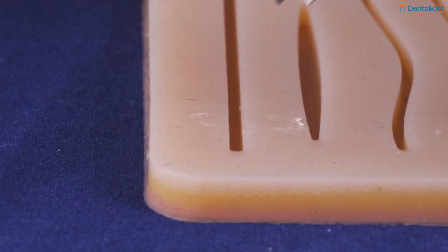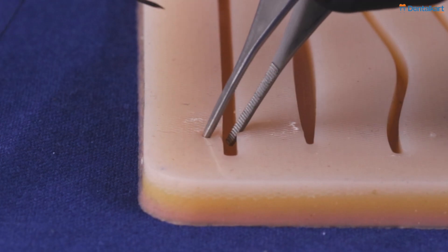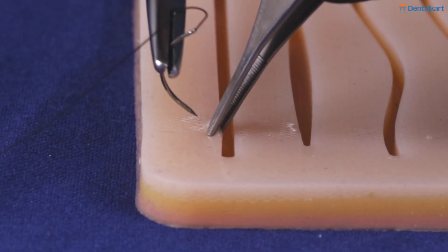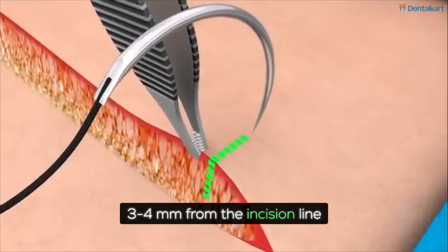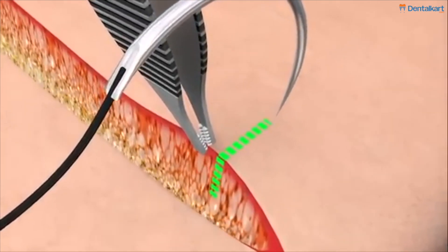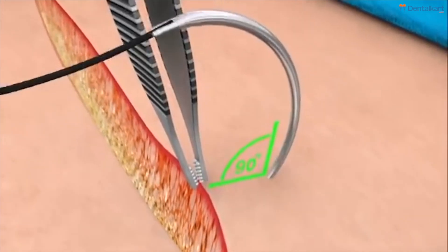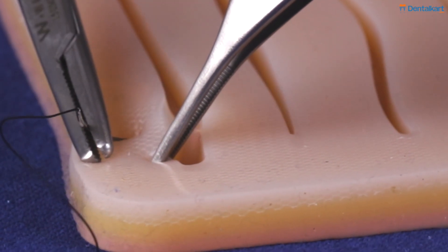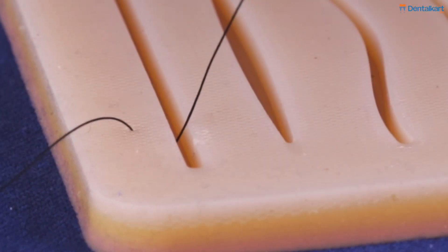Now we will see where we have to insert our needle, at what angle and what distance from the incision line. Typically our distance should be 3-4 mm from the incision line and it should be equidistant on both sides. We should insert the needle at a 90 degree angle. Here we will be showing a 2 bite equidistant simple interrupted suture.